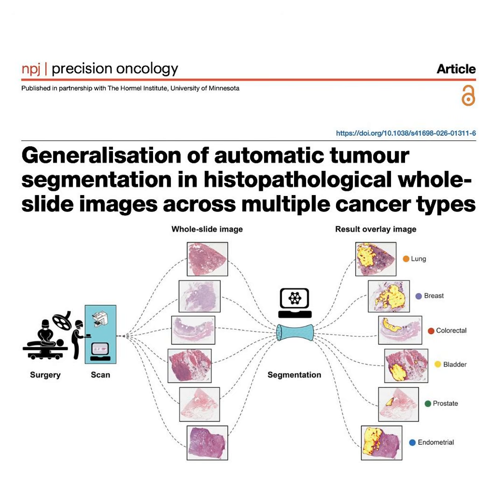Okay, so let's do a quick mini recap for the listener just to lock in what we've covered in these first few minutes. Good idea. Bullet point 1, pathology is severely bottlenecked, so AI needs to step in to save the day. Right. And bullet point 2. Instead of building single organ specialists, they trained a universal model on 4 distinct cancers using over 20,000 perfectly balanced images. And point 3. This generalist approach proved that a single AI can master multiple cancers without sacrificing specialist-level accuracy. That is the foundation, yes.